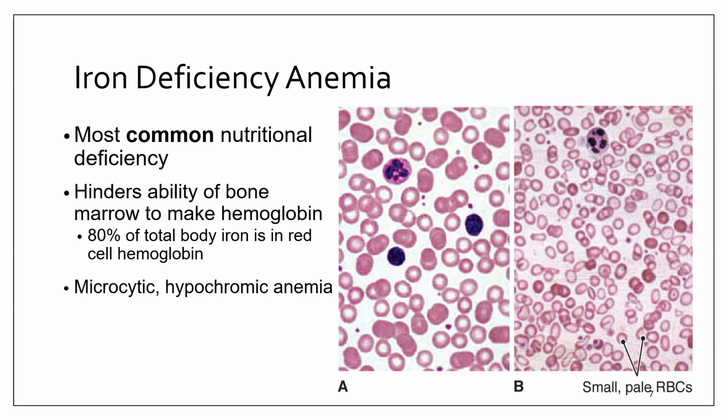So typically this is seen with low hemoglobin, low hematocrit, low MCV, and low MCH, and increased RDW because cells vary in size. Histologically, the smear often tells the story before the numbers do. So even though this diagnosis is made clinically, your slide quality still matters. Thin areas exaggerate pallor, thick areas hide hypochromia. So a well-cut, properly stained smear is essential for recognizing these features accurately. This is one of those conditions where histology absolutely supports diagnosis.